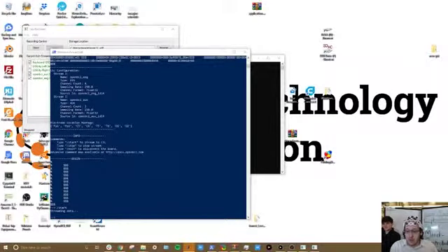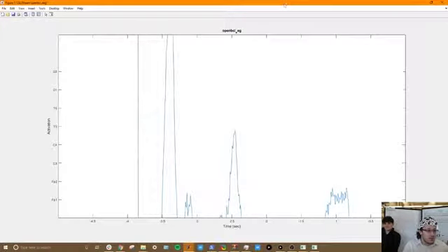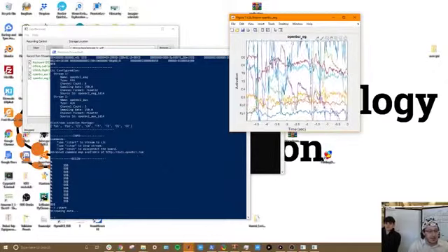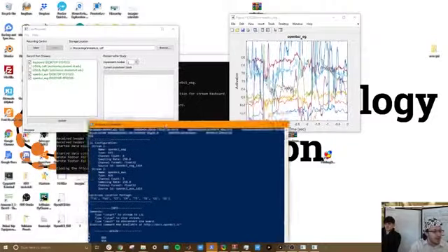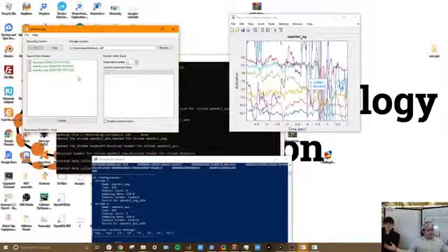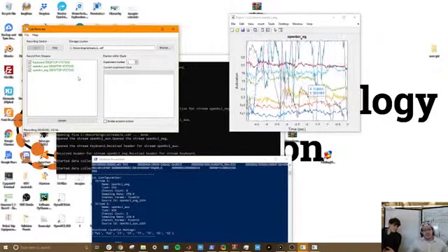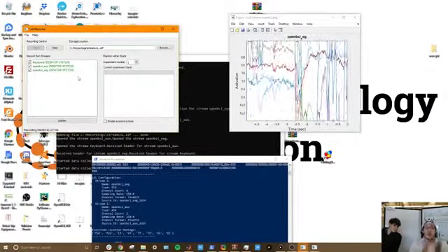Yeah, no, I'm just trying to spawn the stream. Hey, there we go. Give it a second. Alrighty, there we go. EEG stream, running using VizStream. So this is the same script that I was showing you guys a second ago. We had some technical difficulties. For some reason, it was refusing to connect. But now it's connecting. And so now you can see we can actually run this and this at the same time. So I can stream and record the stream. And you can see what my EEG looks like. It auto-scales all the channels, so you see what the channels all look like. So this is an example of how you would go about doing our streaming using our experimental setup.